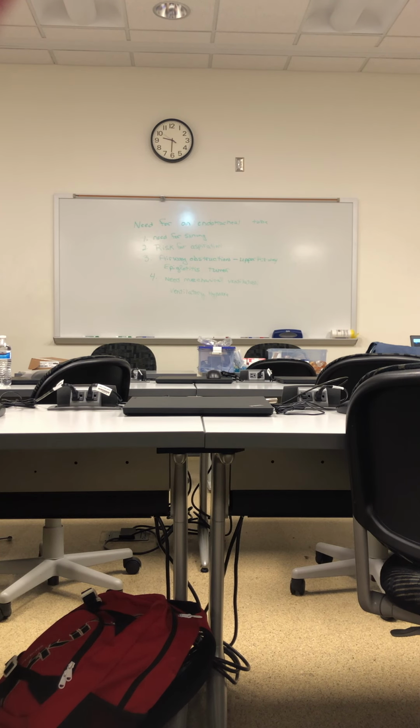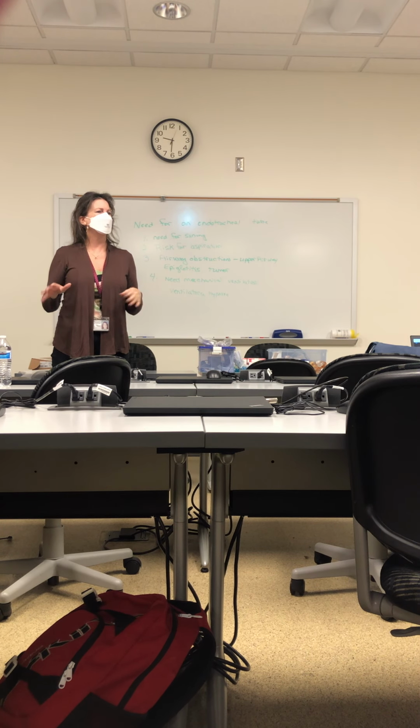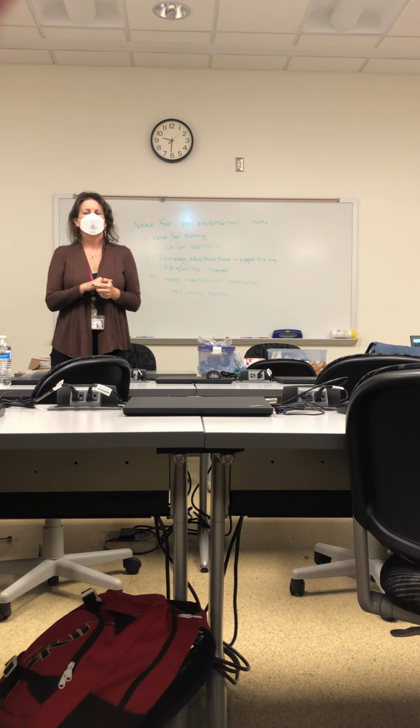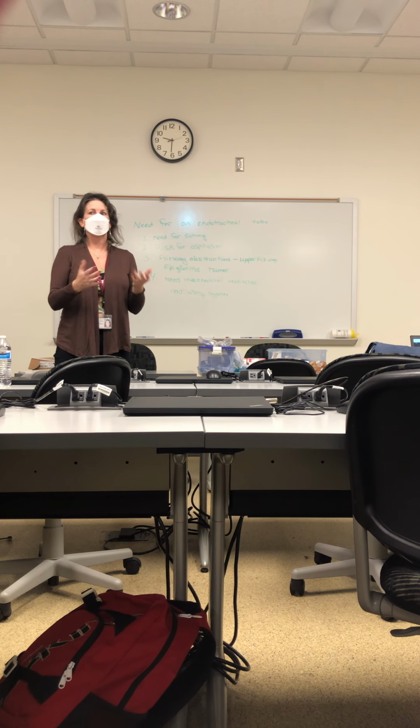Okay, so let's just pretend like we are called to the ED, the emergency department, and we're called to intubate a patient, okay? Now, some hospitals, the smaller the hospital, the more likely a respiratory therapist would intubate.